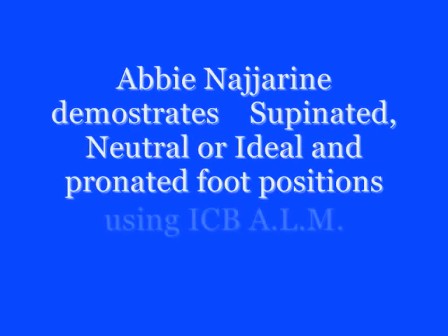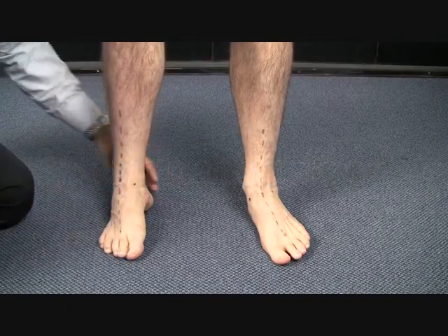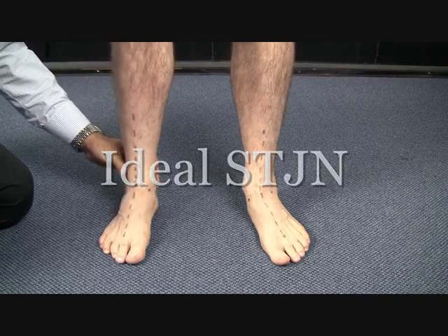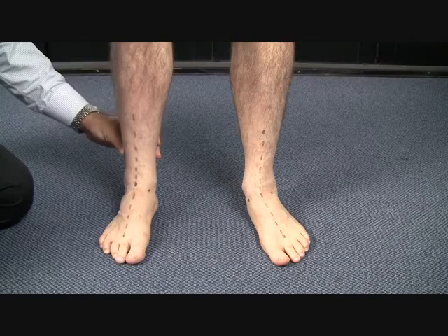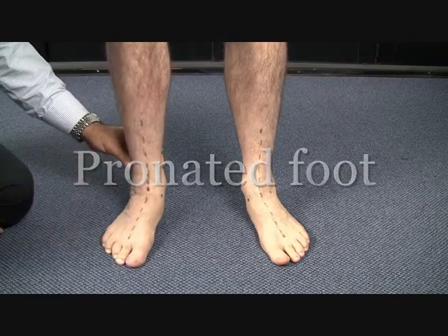Using the ICB ALM, Podiatrist Abby Nargerine demonstrates the supinated foot, neutral or ideal, and also the pronated position of the foot using the line as the reference.